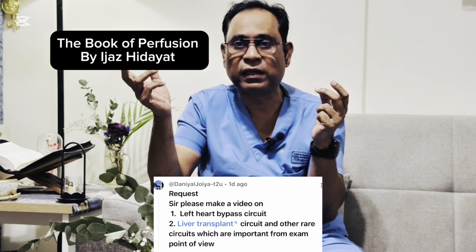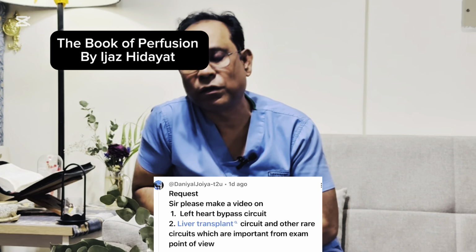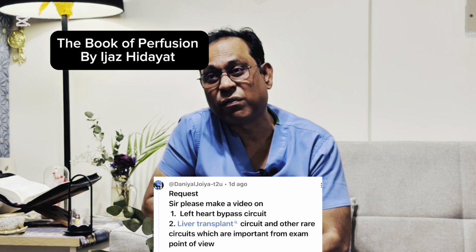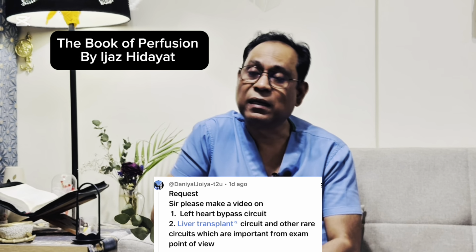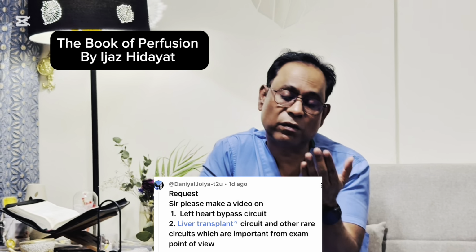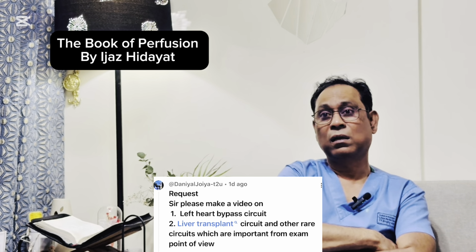This is your cannulation. But in a left heart bypass, we are cannulating into the pulmonary vein or into the left atria, or sometimes even the left ventricle. And for the aortic cannulation, mostly for cardiopulmonary bypass we cannulate the ascending aorta, but here we are cannulating the descending aorta.